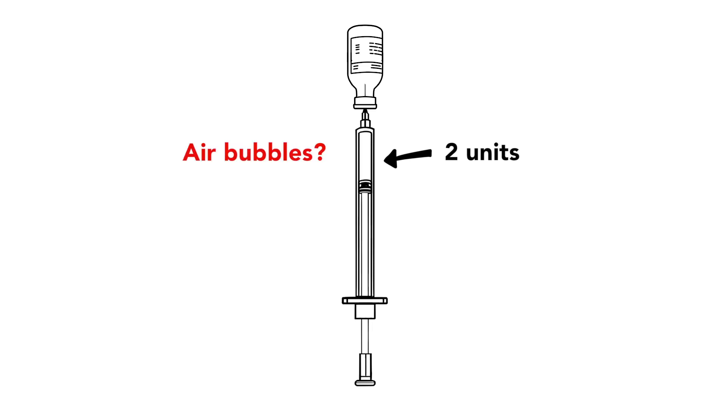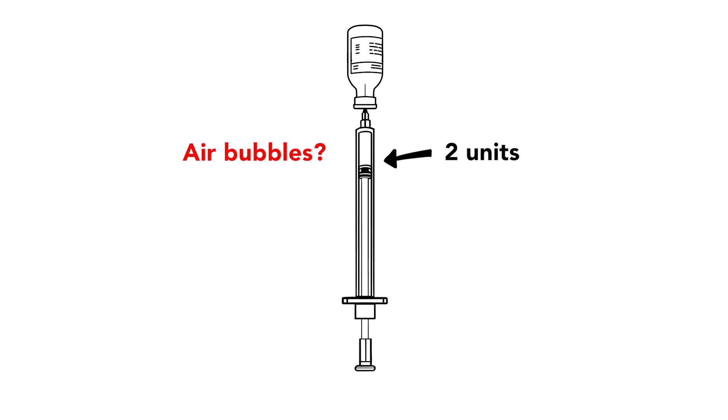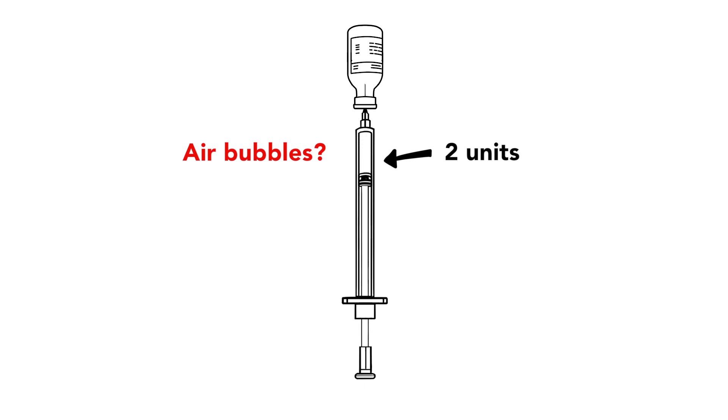If there are large air bubbles in the syringe, push them back into the vial. Then pull back on the plunger to fill the syringe with the right amount of insulin. You can repeat this until the large air bubbles are gone. When you are finished, make sure the syringe has the right amount of insulin and no large air bubbles.